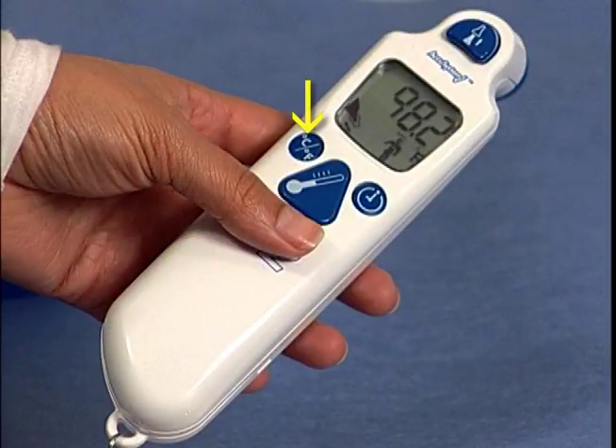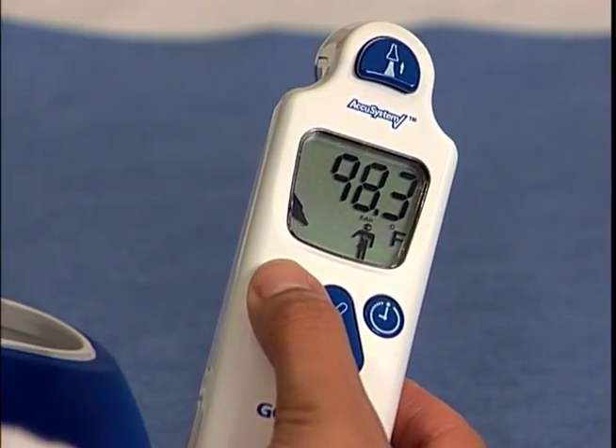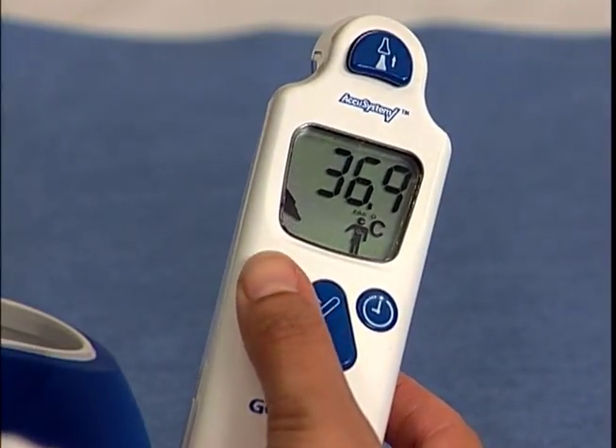The mode selection button, located to the left of the large triangular scan button, toggles the Genius 2 between Fahrenheit and Celsius temperature scales. When the LCD screen is still active, press and hold the button down for two seconds to switch between Celsius and Fahrenheit scales.